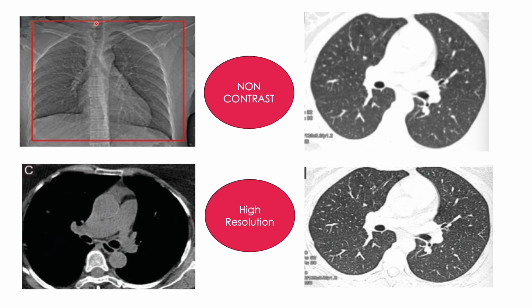Now a non-contrast CT essentially starts acquiring volumetric data. It starts at the thoracic inlet and classically must include the upper abdomen also. Now here if you see, whenever you do the scan, it is done in the supine position in deep inspiration, and the patient is asked to keep the arms extended overhead because that avoids artifacts. Also, we get both the images here. You see this is the lung window and this is the mediastinal window.